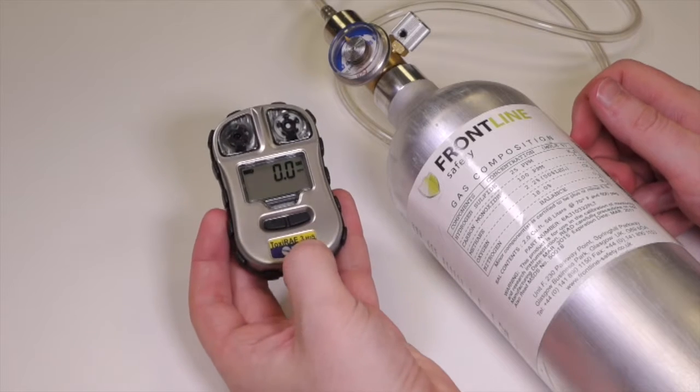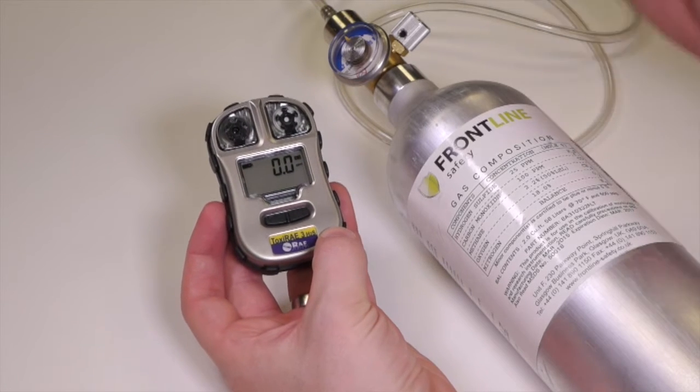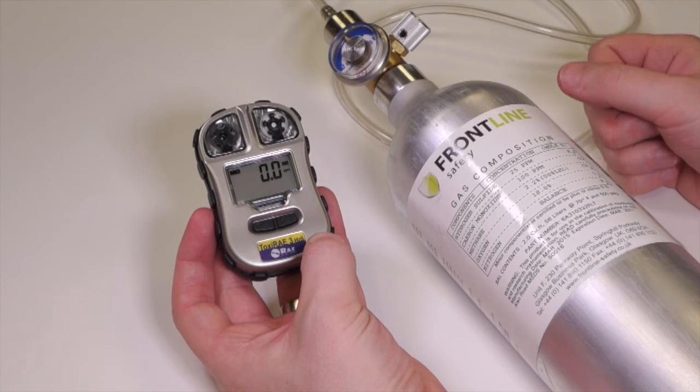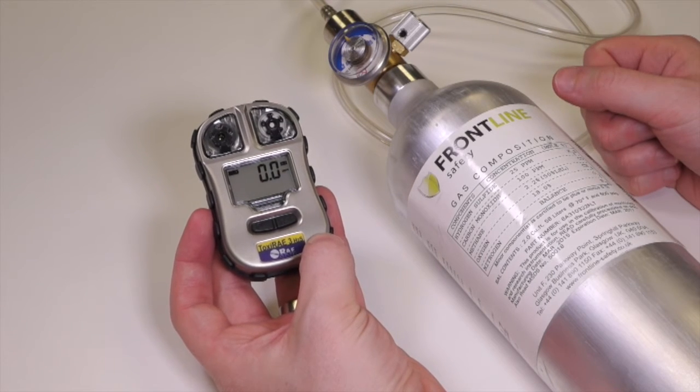If you don't actually have the 25 ppm H2S you can go into the instrument menu and change the span calibration gas to whatever the value is you have in your gas cylinder.